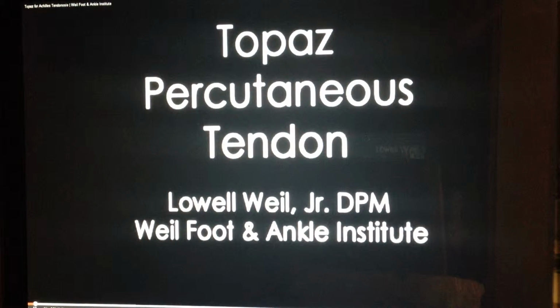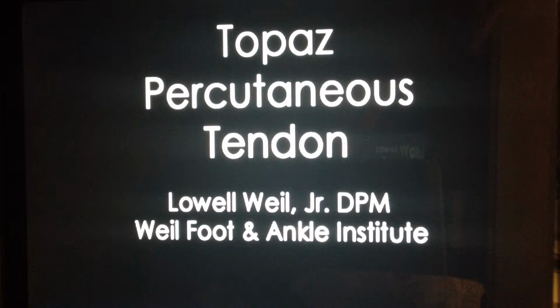Percutaneous Topaz technique for a thickened Achilles tendon. This is a new technique. After introduction of intravenous sedation and local anesthesia, an Esmarch bandage is utilized to exsanguinate the foot. A calf tourniquet is then raised to create the hemostasis needed for the procedure.